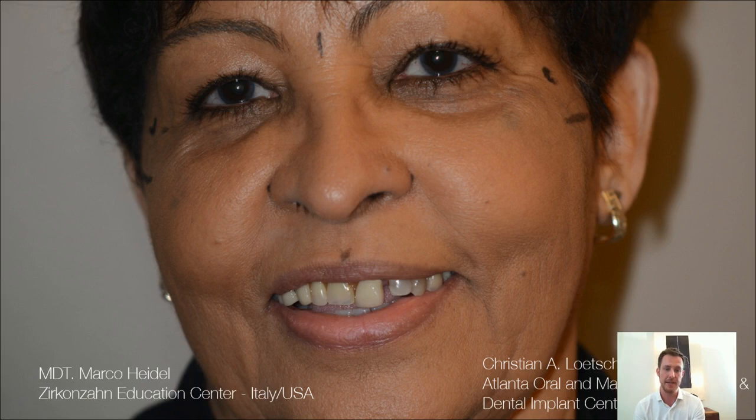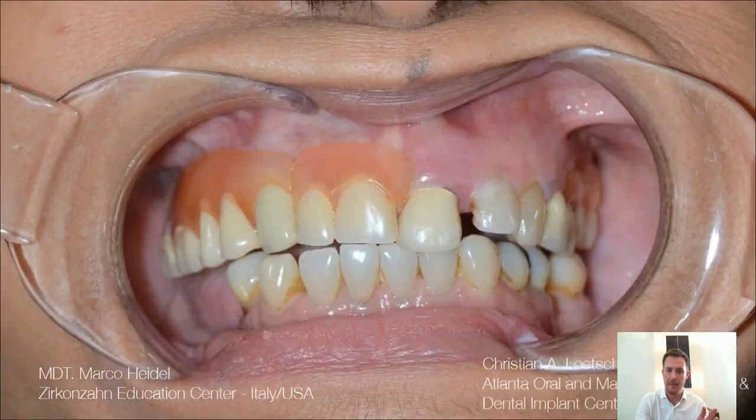The patient has some dentures in his mouth. What is just natural is that crown here and those little crowns here to the side, but everything else is just prosthesis. And it was a kind of challenge to make a diagnosis and to create a kind of try-in for the situation here, because of the position of the teeth.